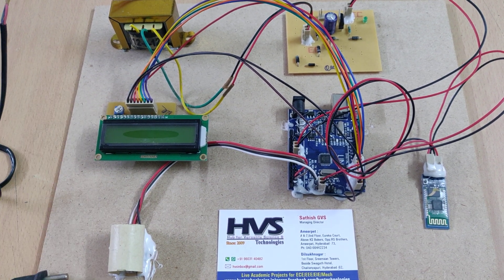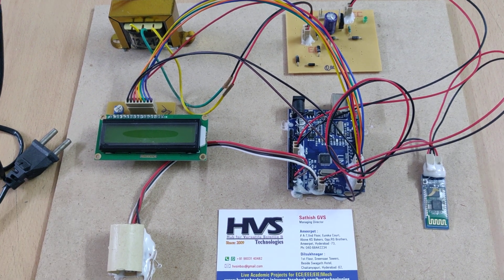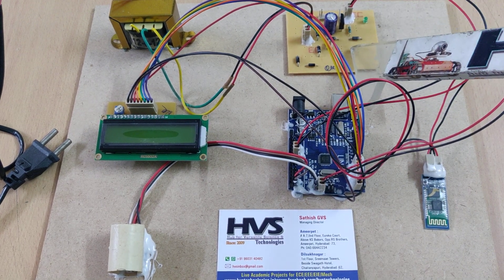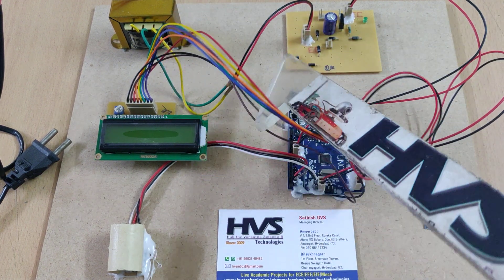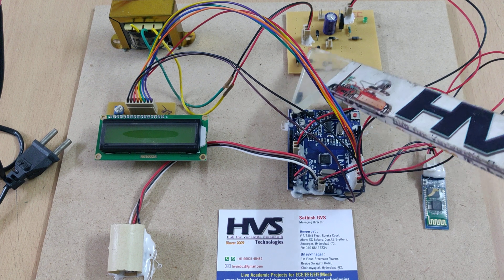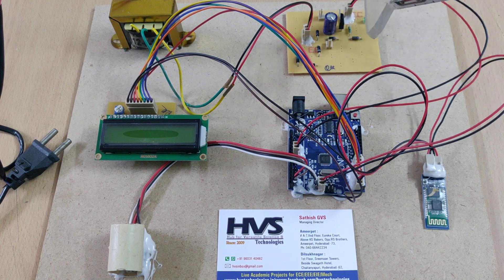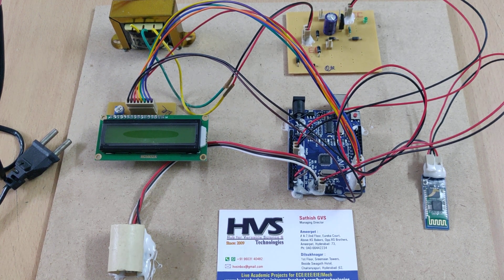For the power supply, we provide mains input to a transformer that steps down the AC voltage to 12V AC. After the power supply board, we get a constant 5V regulated supply. Four diodes are used as a bridge rectifier, and after rectification the capacitor removes the pulsating DC to give pure DC. The 7805 regulator then provides the final stable voltage.